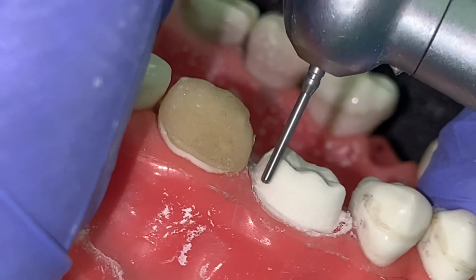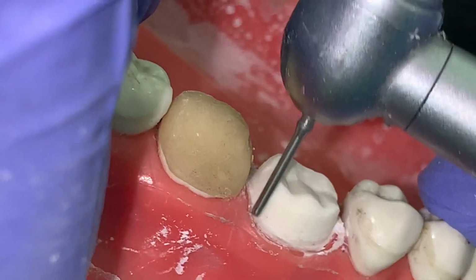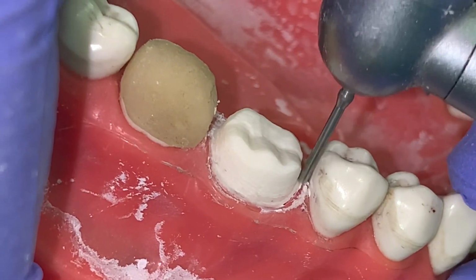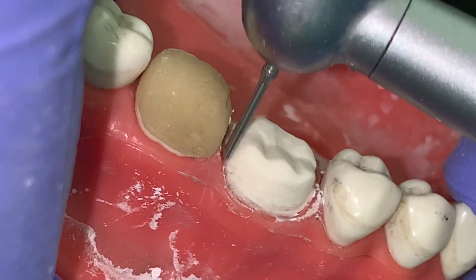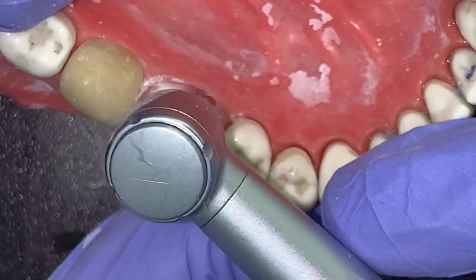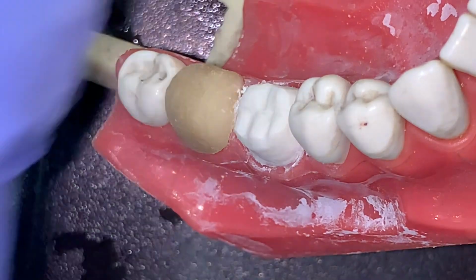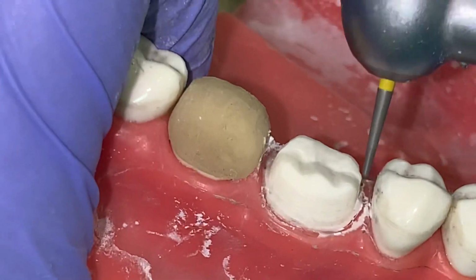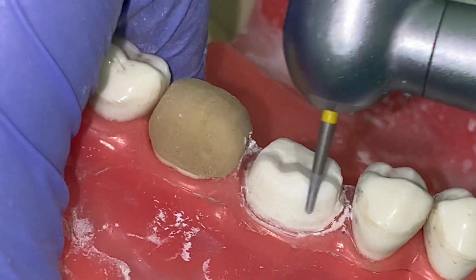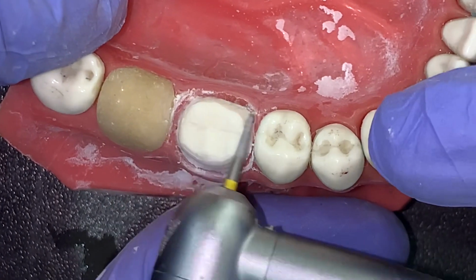This is a burr specially designed for margin refinement. It is only a tip cutting burr, so you can refine the margins with this. Sometimes we get some tooth projections or tiny lips of enamel that are sticking out of our preparation, and these can be handled using these tip burrs. This is a finishing burr, yellow labeled. So I'll be using this burr to finish the preparation.